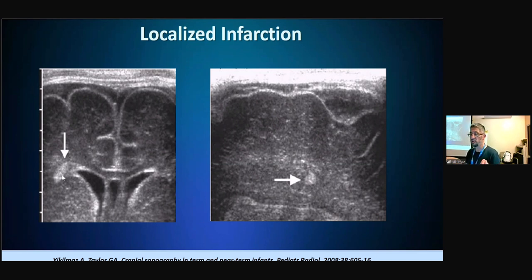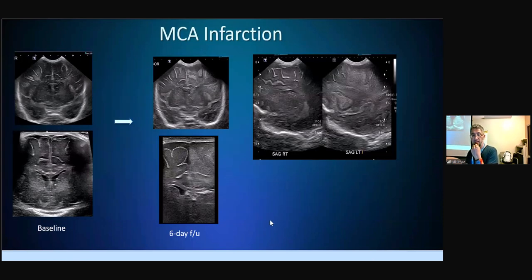You can see a small infarction in the brain. It's just an echogenic focus. Is this hemorrhage? Could be. Is this infarction? Yes. It's very non-specific. But it can also involve large arteries.